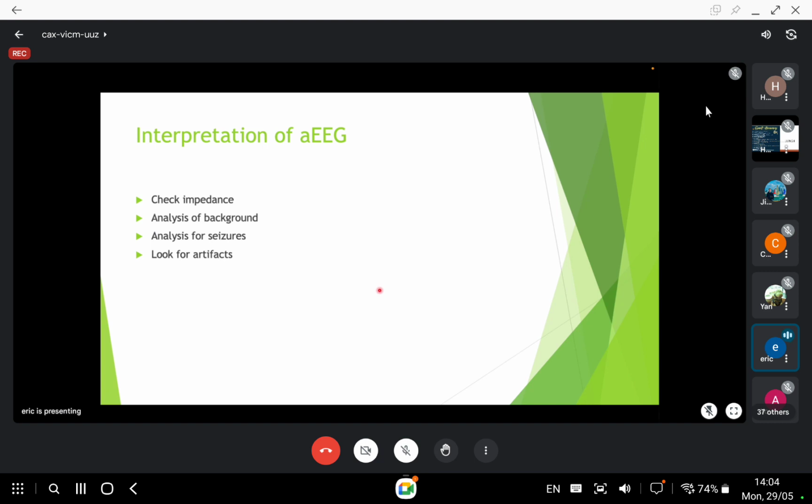AEEG in regards to how to place the electrodes. So I'm not sure what machines you all are using. I've heard that certain centers have different AEEG monitors. Kulim has which one again? Philips, is it, or something like that? Minray. We have Minray here in Kulim. I didn't get to see your machine the other day, so I wish I could have seen it.